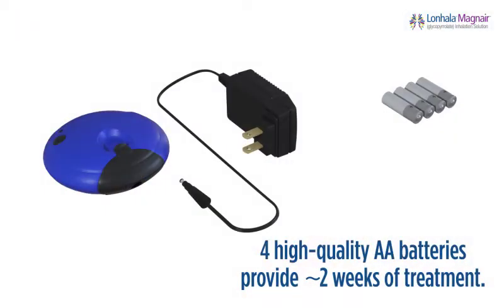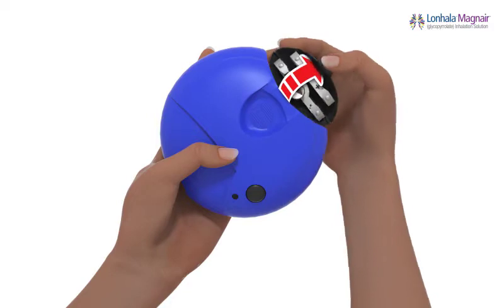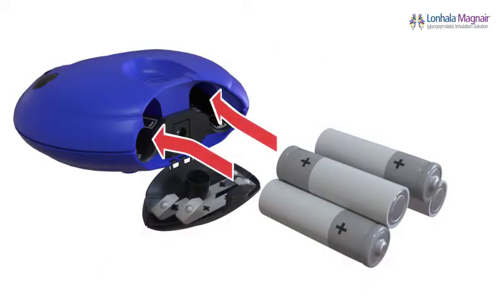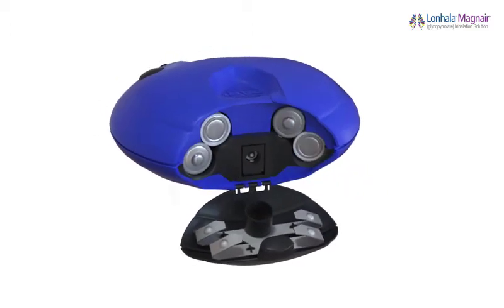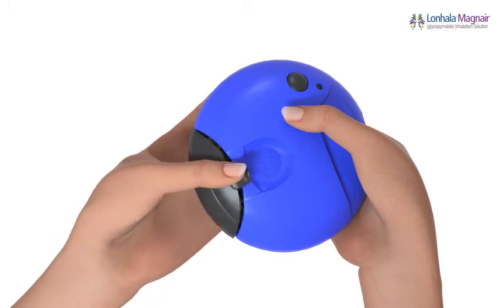Let's get started by assembling your Magnair. Magnair can be used with AA batteries or with the AC adapter. To insert the four AA batteries, open the black battery door on the controller by placing your thumb on the black tab and firmly pushing the tab. Using the battery tips as guides and starting left to right, insert the four AA batteries tip out, tip in, tip out, tip in. To close the battery door, push it closed until you hear it click into place.